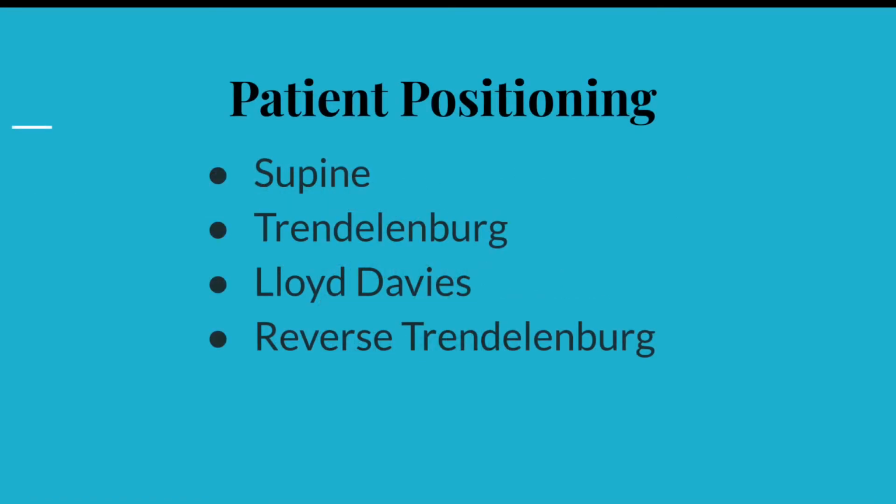Laparoscopic surgery has established itself in the field of minimally invasive surgery over the past 30 years and has been evolving since then. Benefits include faster post-op recovery, reduction in length of hospital stay, and more importantly, avoiding large open wounds or incisions, thus decreasing blood loss, pain, and discomfort. Hence, patients have fewer unwanted side effects from analgesia, since overall less analgesia is required.